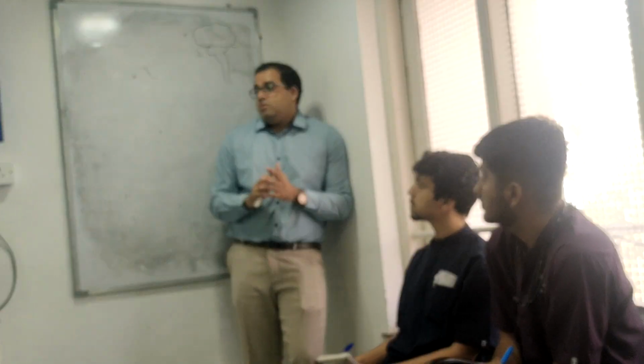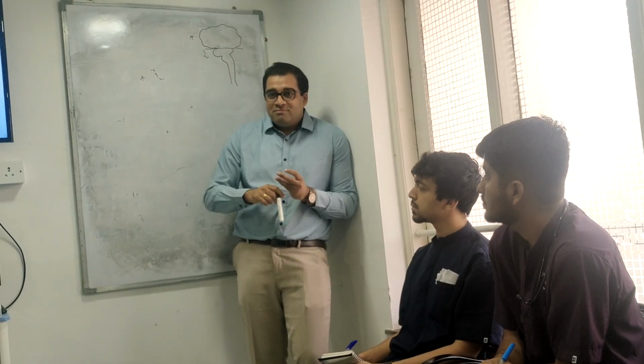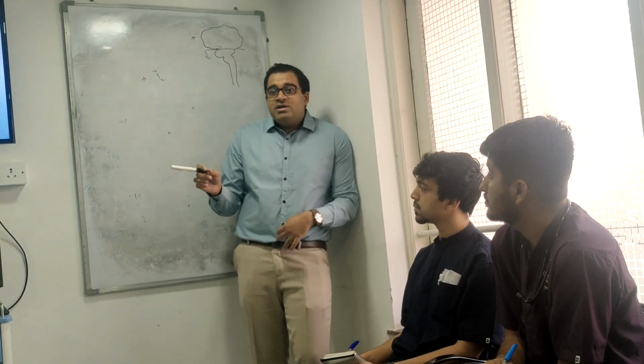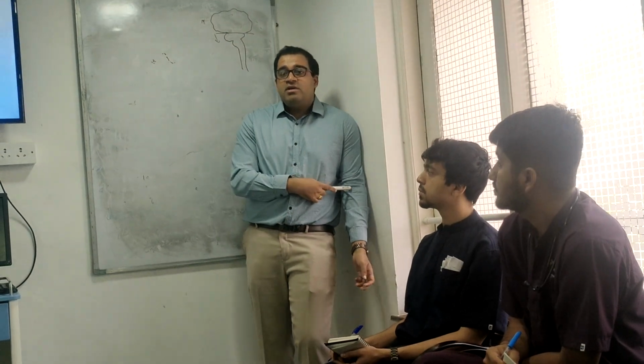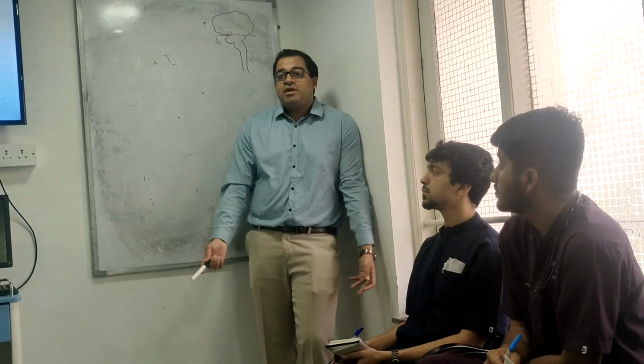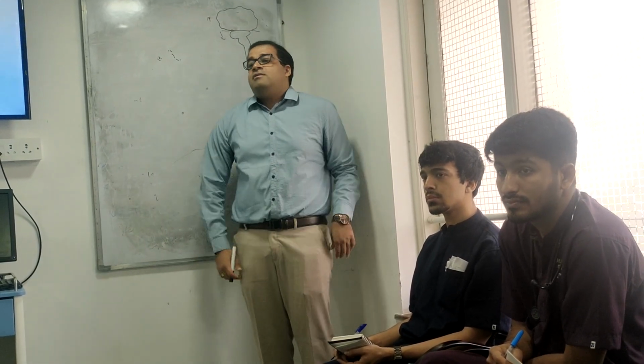Most likely. Always, never disregard. Why? I will always look at the second bottle. And if the second bottle is positive, then something is wrong. This is a true bacteria. Understand this. The second bottle matters because it comes from a different prick. What are the chances that you will contaminate both pricks with the same organism? Unlikely.